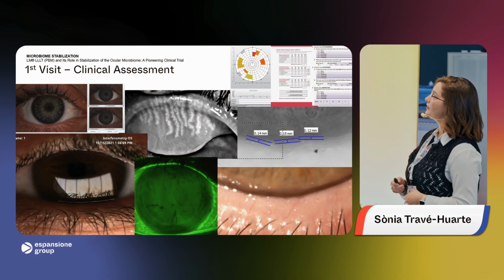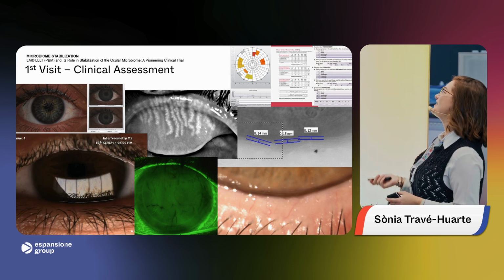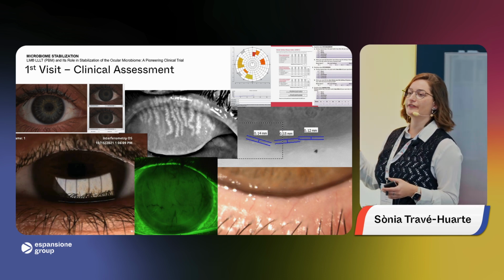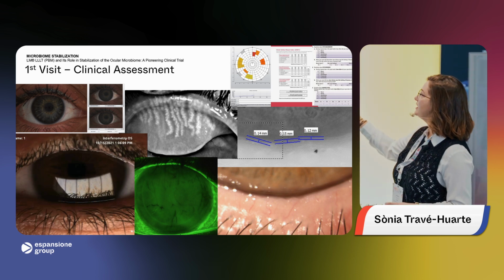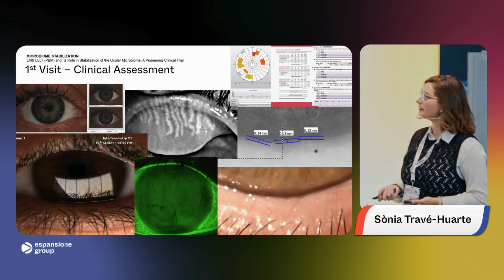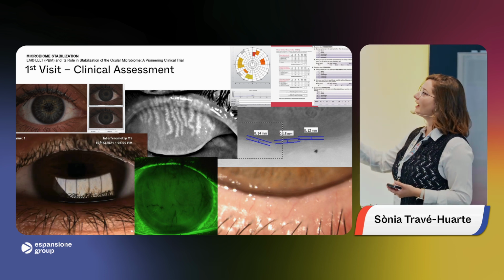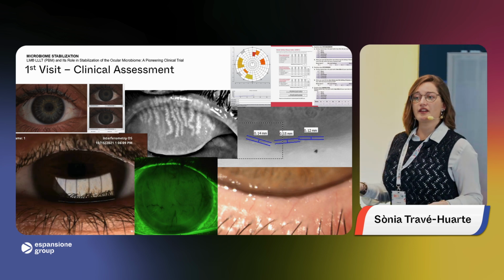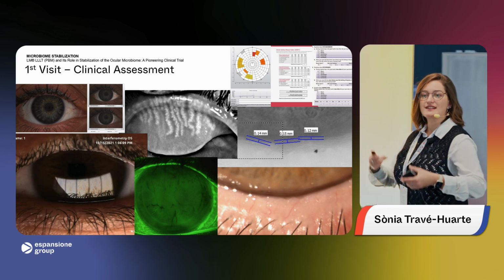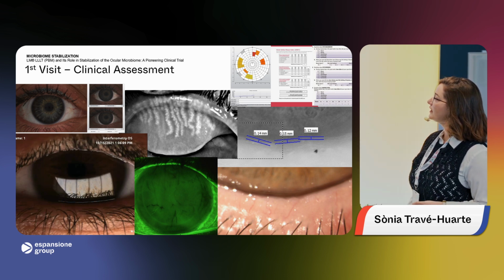For the clinical assessment on the first visit, we do questionnaires. I love questionnaires. I always do questionnaires. I need my numbers. And then we follow with tear film stability tests, either volume or quality. So we have tear meniscus height and breakup time. I also look at the redness if we're looking at inflammation, even though it's not in the lid margin itself. We also look at the ocular surface lipid layer, because we know that the red light could also activate those cells and the meibomian glands to flow out.